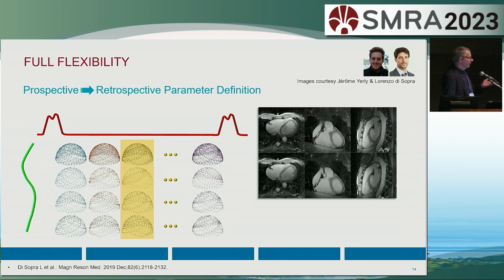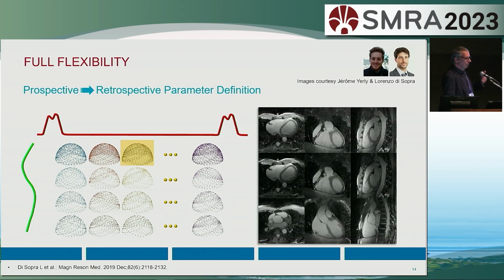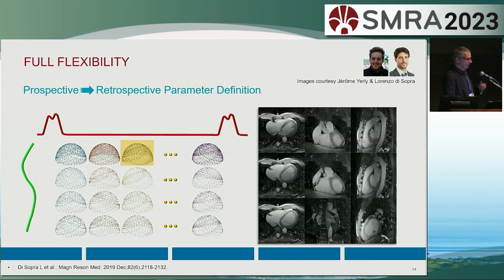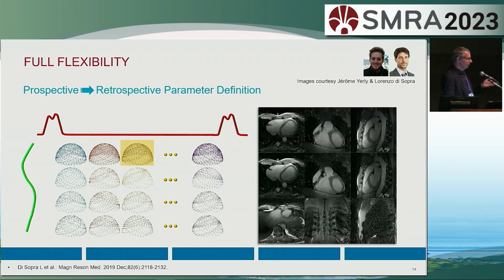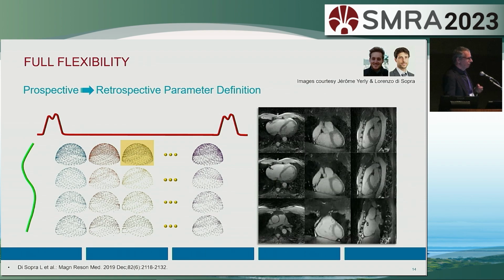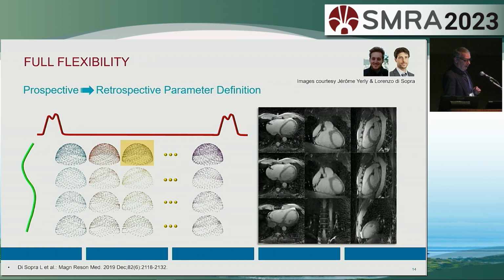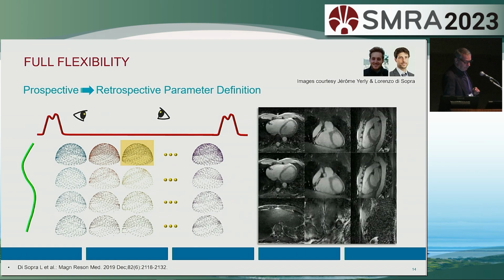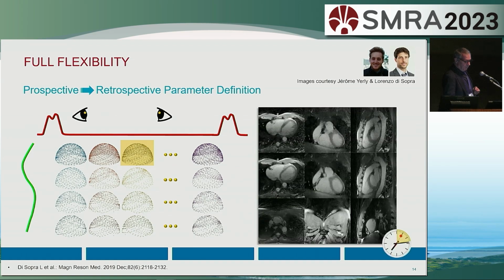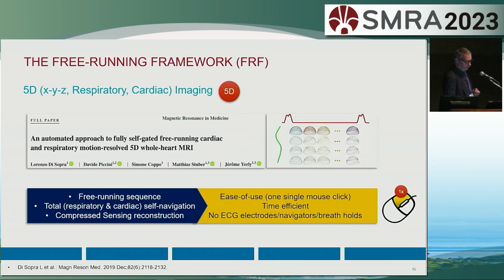If you're so inclined, you can also go into the respiratory dimension, or you can interrogate the data set and go through space and look at the different reconstructions at the different levels. And here you can now retrospectively tease out all the different orientations that you are looking so carefully for in the 2D exam. Now, this acquisition time is not quite a quarter of an hour.